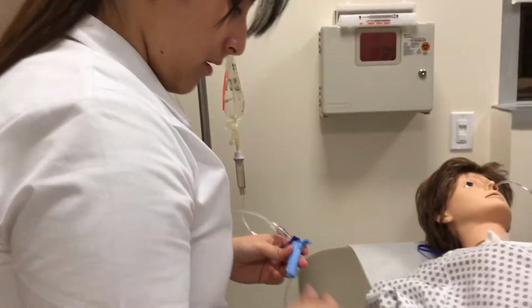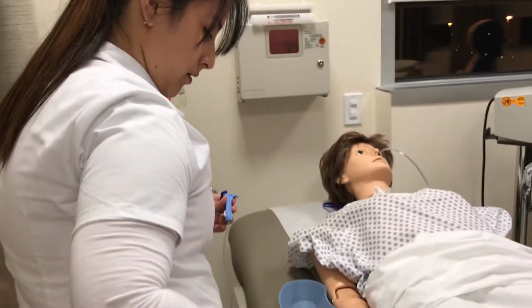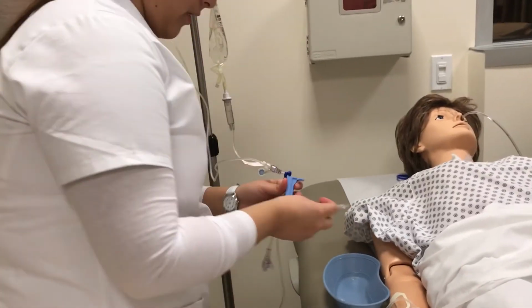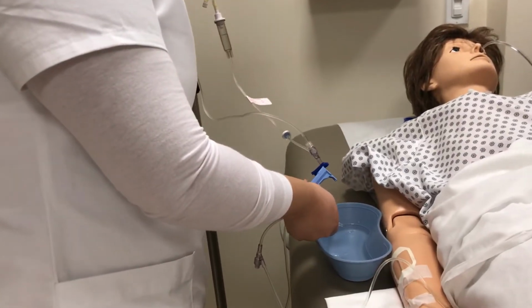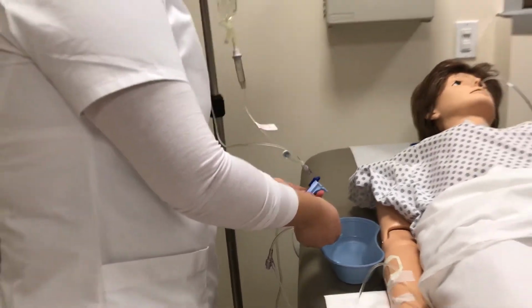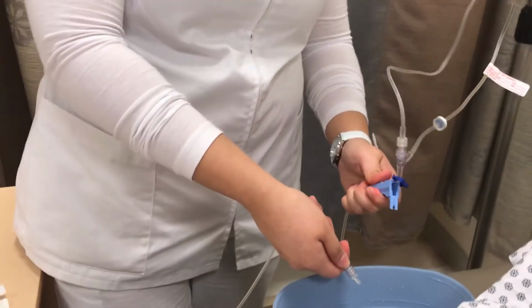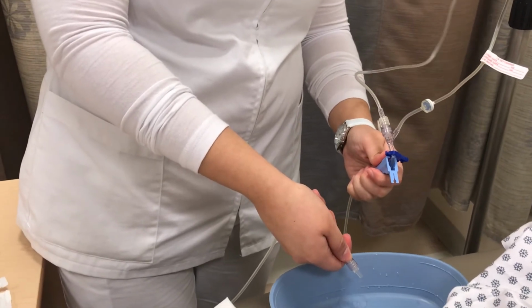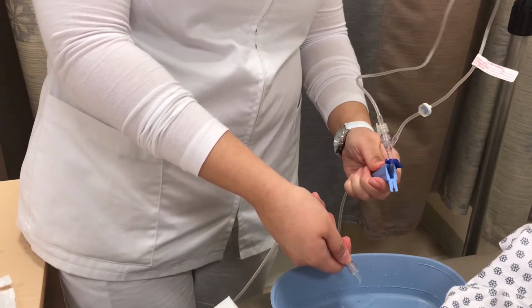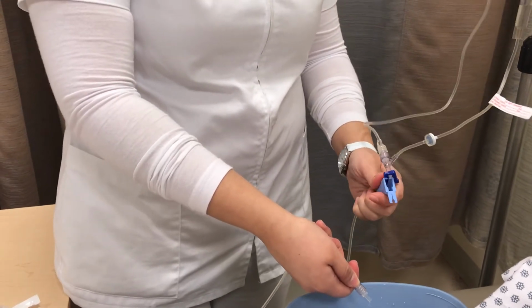Now I'm going to be checking for air bubbles once again, because it is hooked on the IV, the primary IV. And making sure that it's dripping.